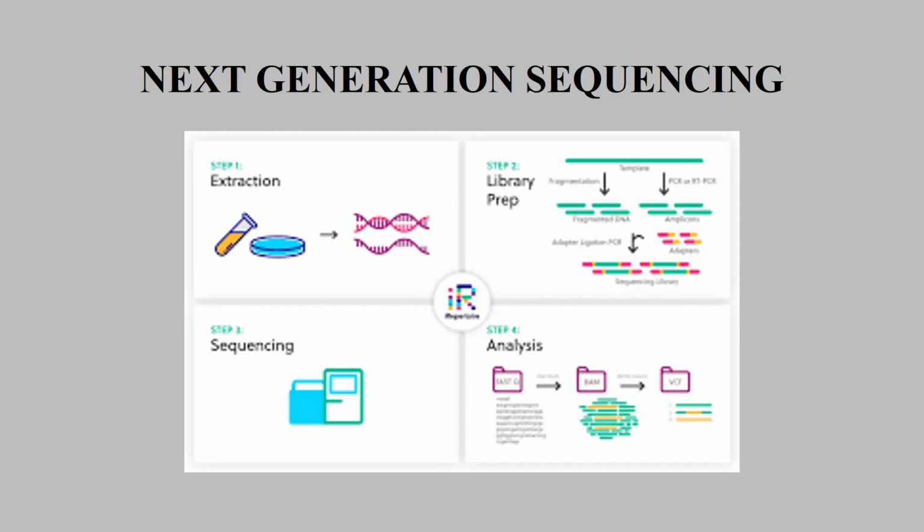It's nowadays the last word of science in diagnosis. Usually this method is used for genetic mutations in different tumors, lungs, breast cancer, and some screening of genetic mutation. A very useful method.